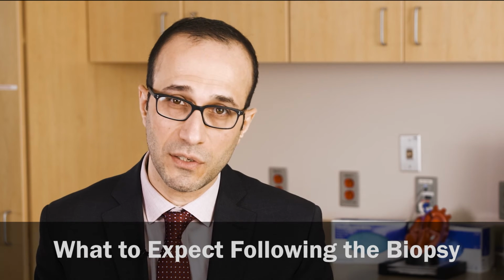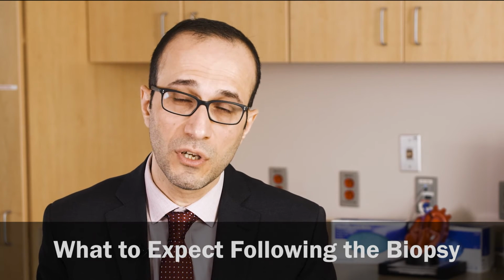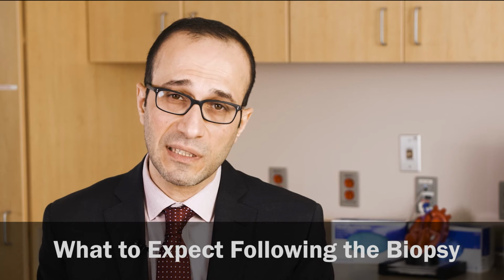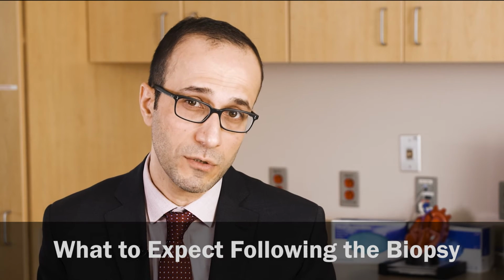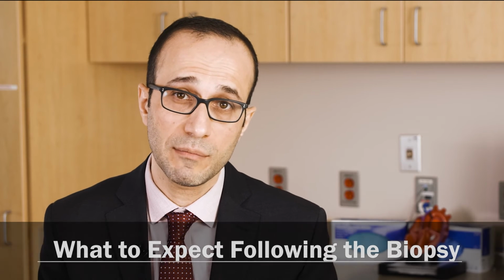The benefit of doing this sometimes is that we can still do the conventional biopsy and do a random or somewhat random sampling of your prostate. Following the procedure, you should expect some blood in the urine, blood with a stool, or blood with semen. Typically, blood in the urine or stool will take a few days and will resolve on its own. Sometimes it represents a problem and you need to tell your provider if you're passing clots or if you are unable to pass urine.